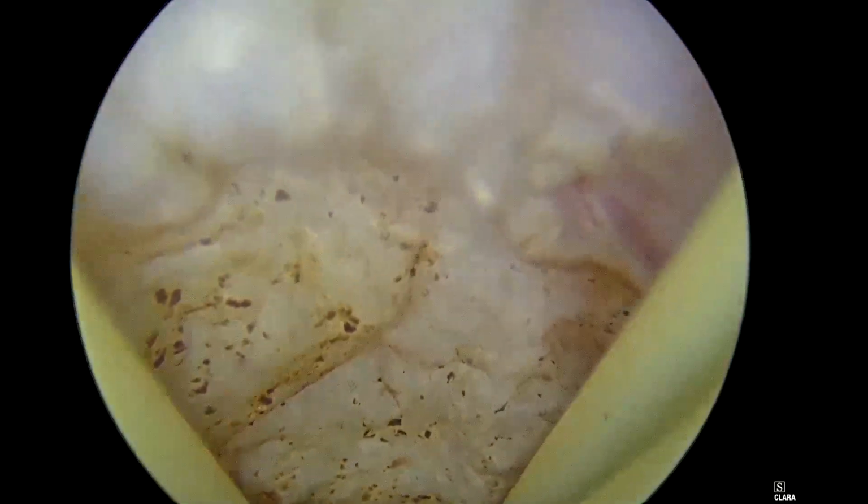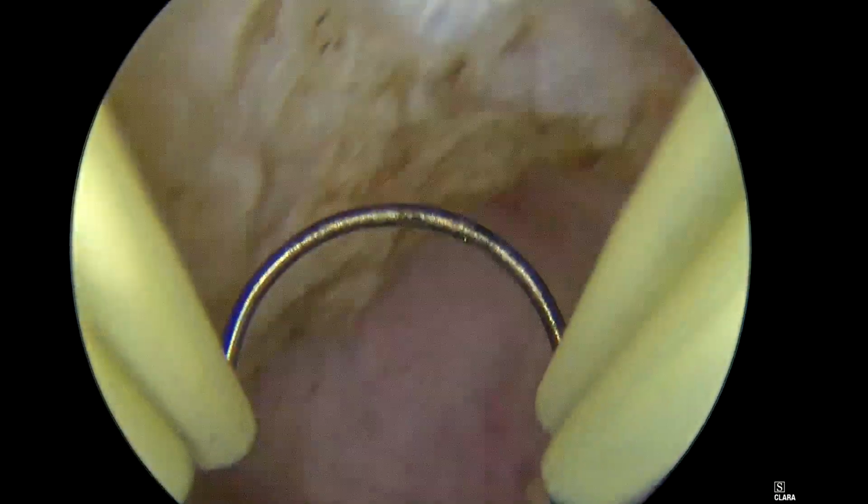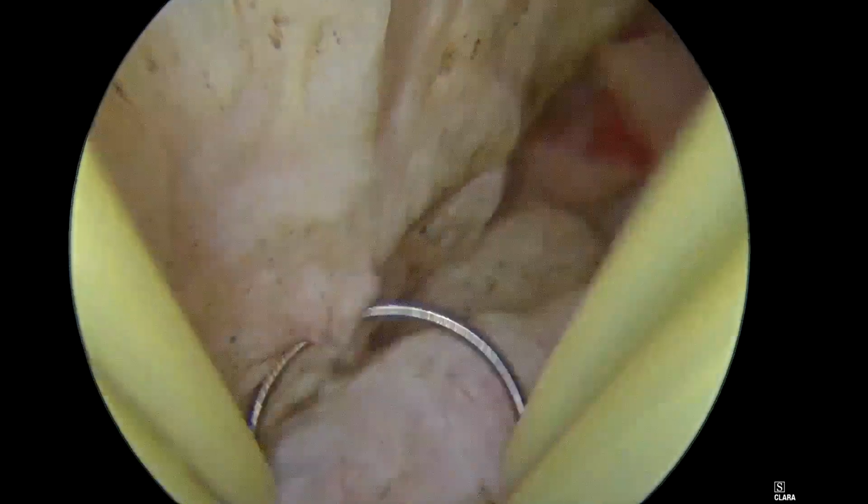That's why the sucking of gas bubbles is more dangerous. Actually, I didn't give much attention to these showers of bubbles. I thought it was minimal and would not compromise the patient's life.